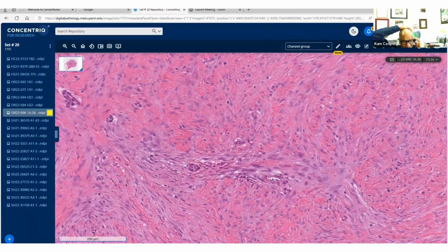Okay. So the reason I put this on, because I was looking for something that we had a few minutes and Charlie has given us some time, is that you're spot on. This is a fibromatosis, but even though we have pretty good morphology on this excision, which is fairly straightforward, on biopsies, we always resort to the immunohistochemical panel in order to delineate that these are in fact fibromatosis.